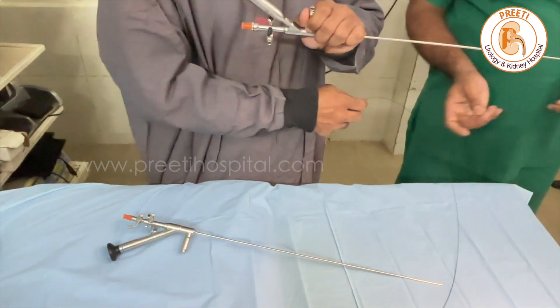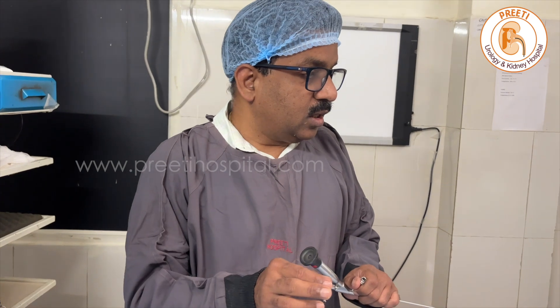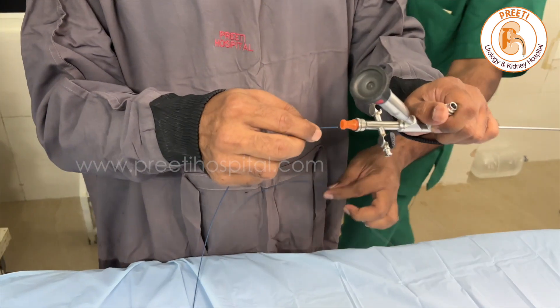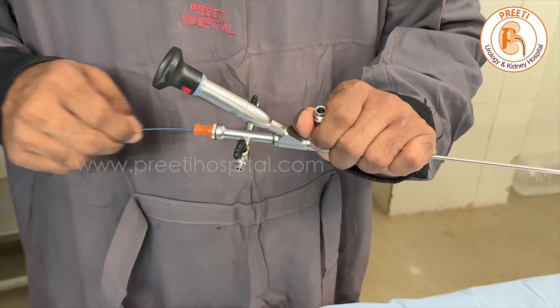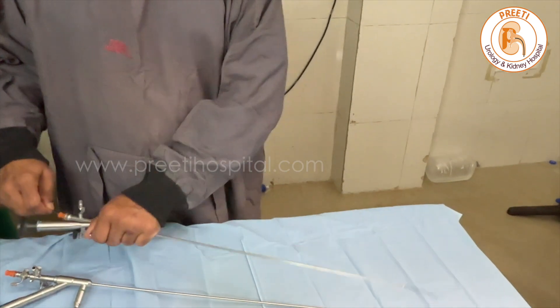The second thing is it also passes a basket — a 3 French URSL basket. This is a very useful basket. In difficult times, you can take the small fragment out like this.